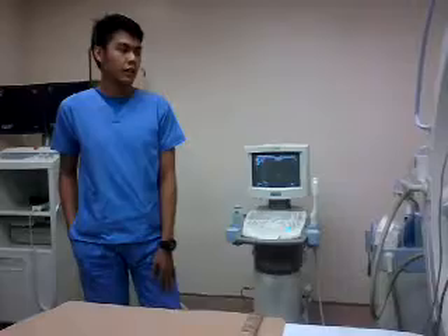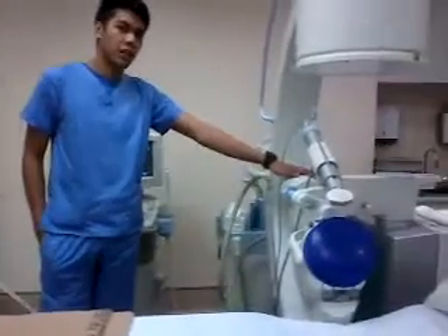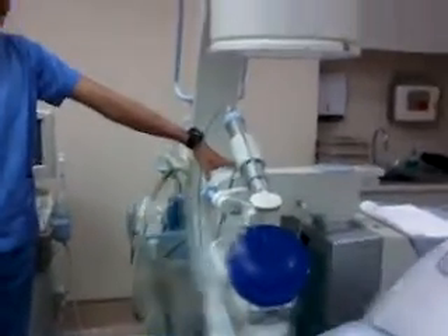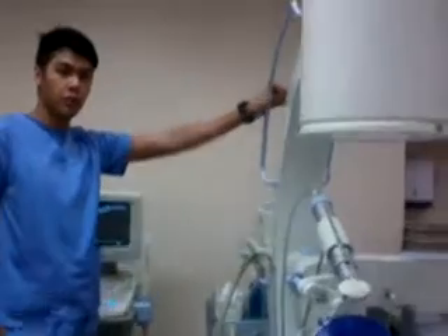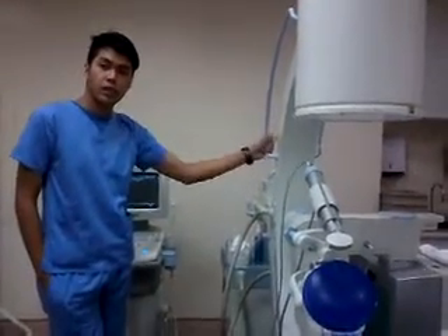We use the main machine itself — the shockwave machine — which provides the shockwave to treat the stone patient through the procedure. Next is the C-arm, which is a fluoro-guided imaging method. We use this for ureter stone location.